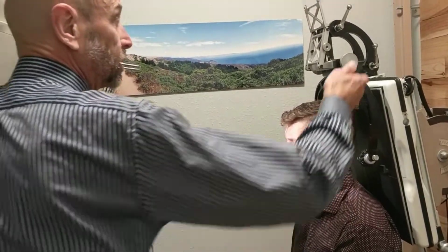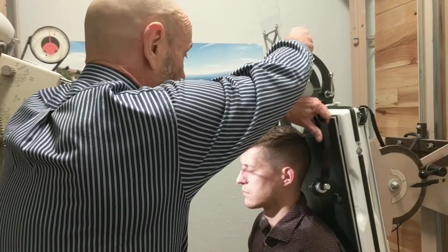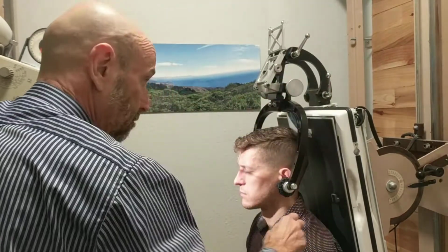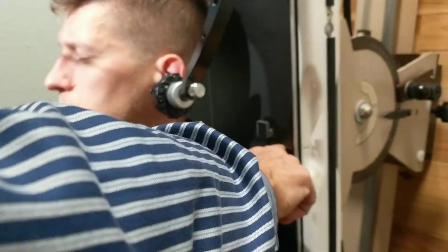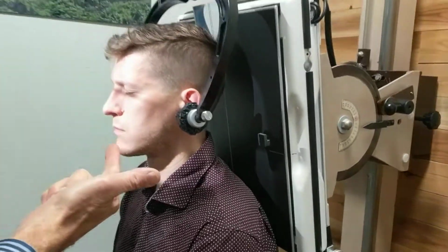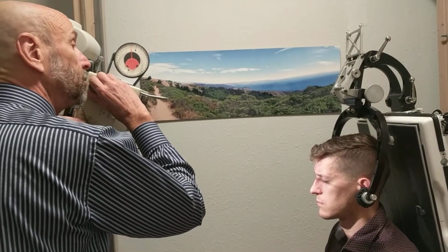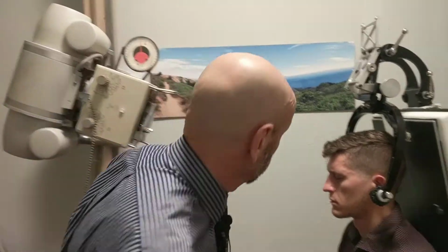And then at this point we can also set the head clamps so that they will go over the transverse process. But a good way to determine that is that when you have the beam on, you can see the shadow of the head clamps right over the center. So now you know that the atlas is in the center of the bucky, that the central ray is going to hit that spot, and that your head clamps are in the same place. So that's a good position. Then we do our collimation, put in the filter. Nasium still requires a filter in most cases.